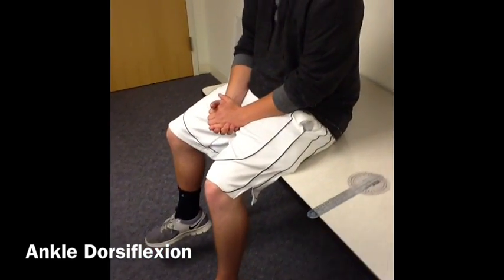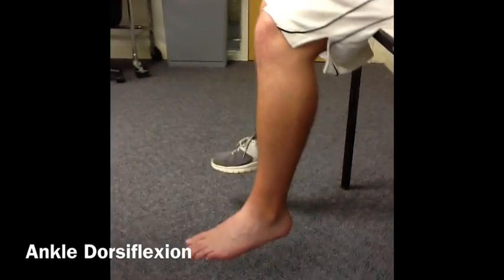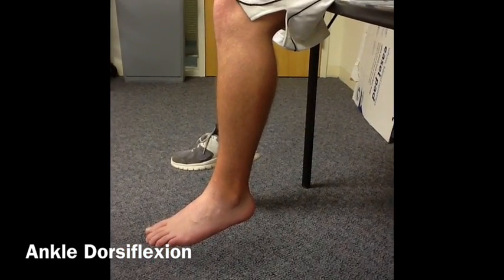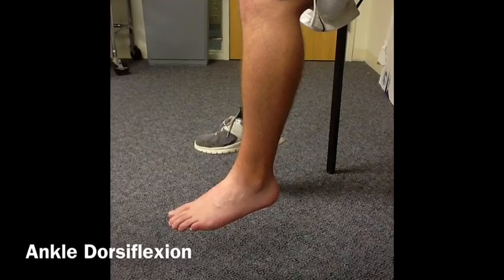First, we will begin with examining dorsiflexion. Have your patient in a short sitting position, so instruct them to sit at the end of the table with their legs bent. Then, to test their movement, ask them to point their toes towards the ceiling.